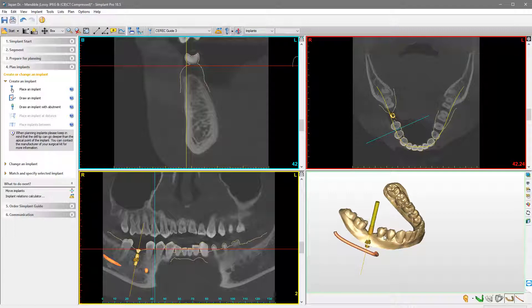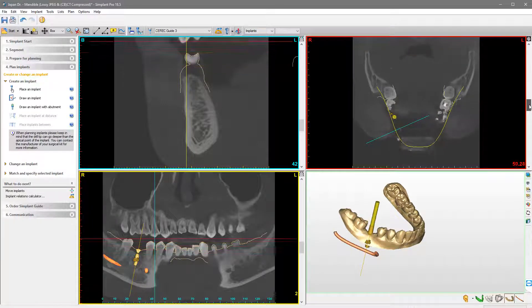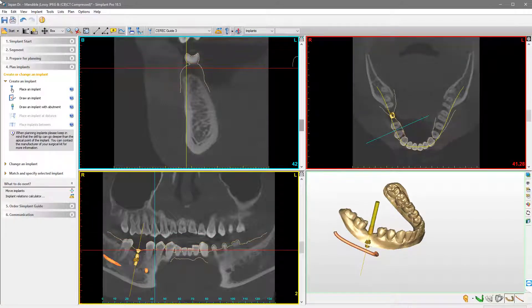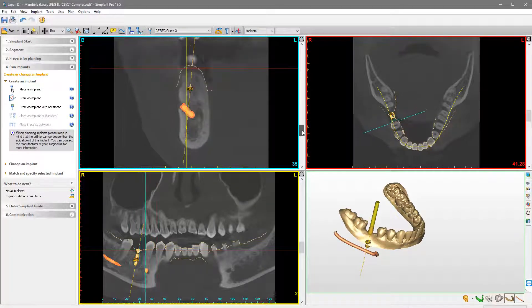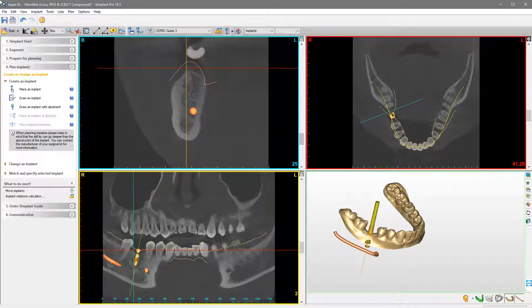Alternatively, you can use the scroll bar on the right of each 2D view to scroll through the image — first in the axial view, then in the cross-sectional view, and finally in the panoramic view. But this time, we demonstrate an alternative option and move the mouse on the view and scroll through by moving the mouse wheel back and forward.